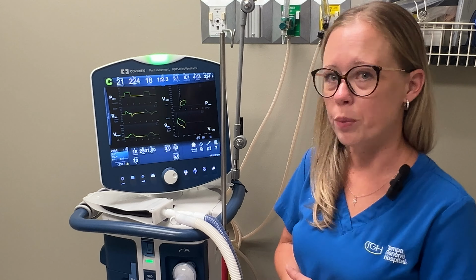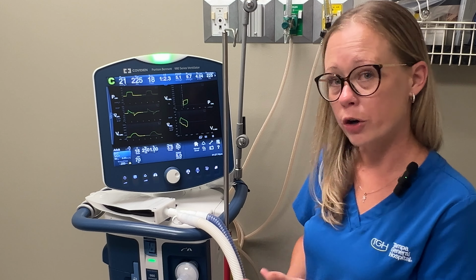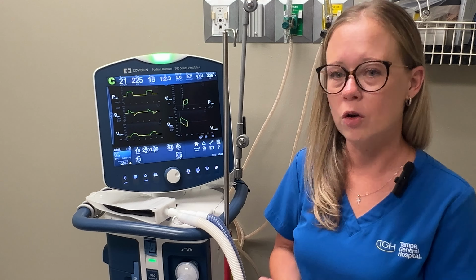We might also, in that waveform, see some turbulence, and we call it the sawtooth pattern. So it looks like this, up and down, a bunch of spikes. That indicates condensation or water either in the vent circuit, or the patient has a lot of secretions and they need to be suctioned. A good habit to get into before suctioning your patient is hitting the 100% O2 button.